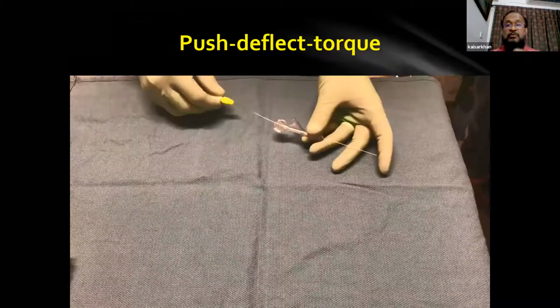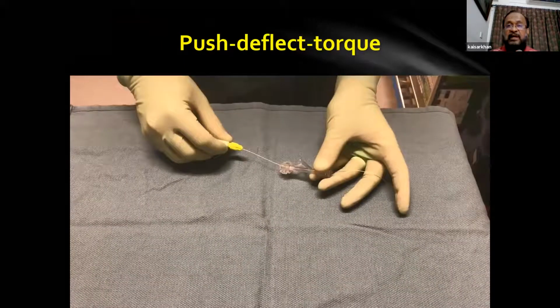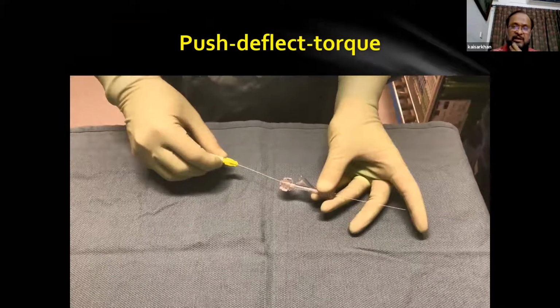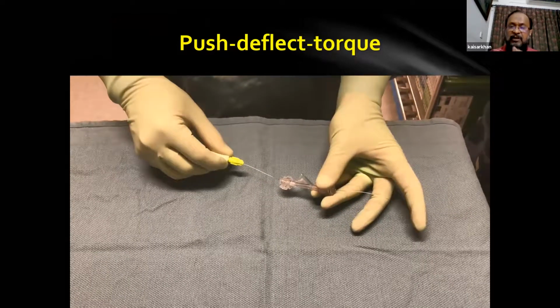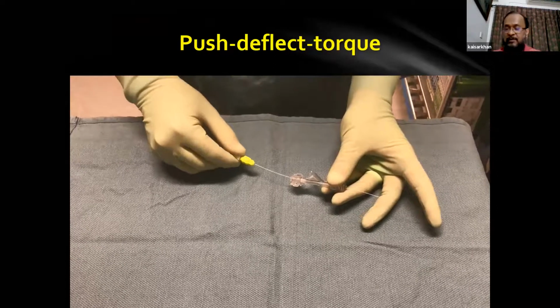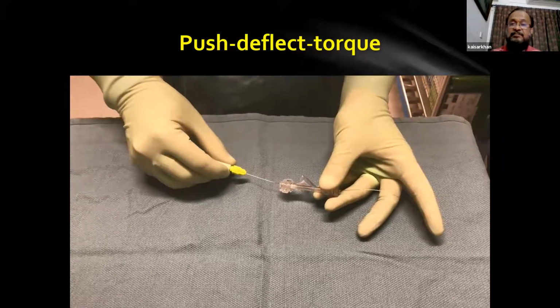And this is, you can see push, deflect, and torque. You push the wire. If the wire is going in the wrong direction, it will deflect. Then you just deflect the wire, rotate and change its direction, and then again torque. This we use for Gaia series.